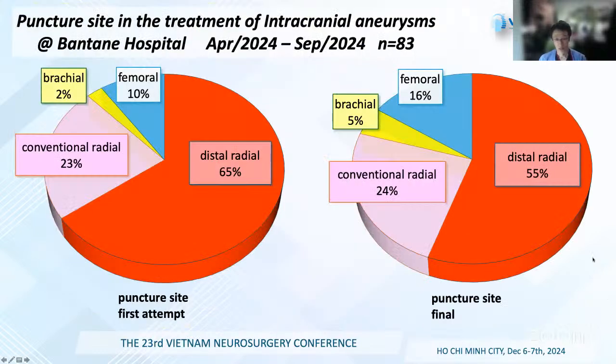So this is the summary in our hospital over only 6 months, about the approach site. Most of all procedures for aneurysm treatment are performed via the transradial approach.